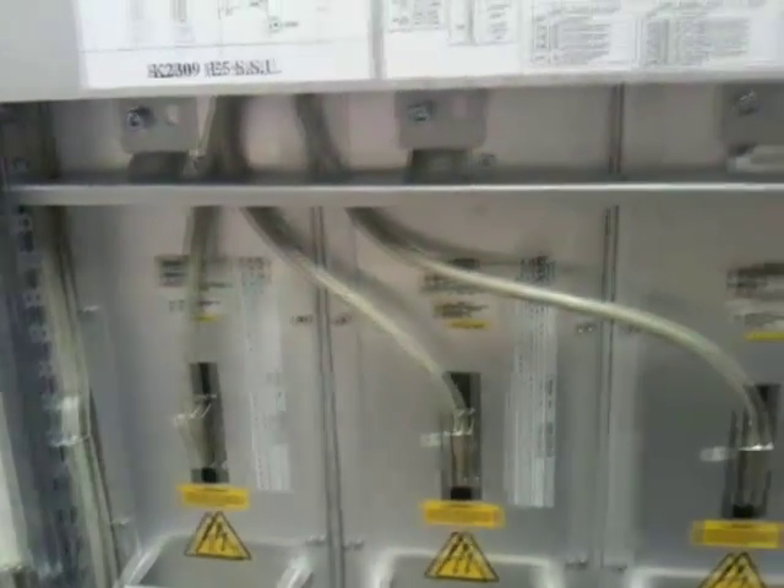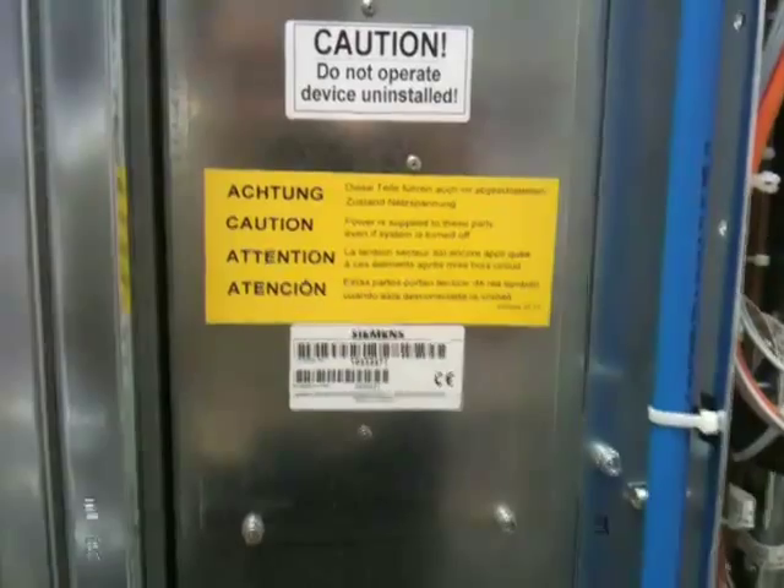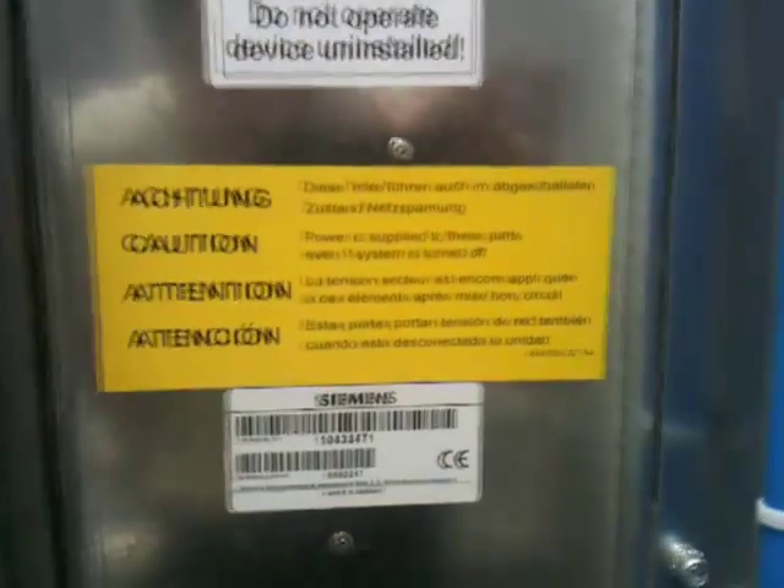This is the main control cabinet — a bunch of signal processing and some sort of high voltage equipment in there. Not quite sure what it is, but it needs a lot of cooling water. You can see the chiller pipes connecting in there.